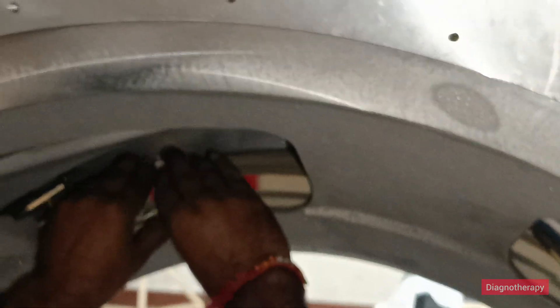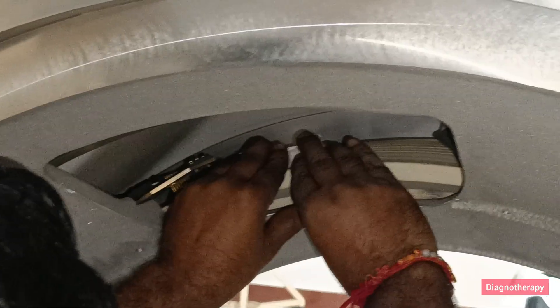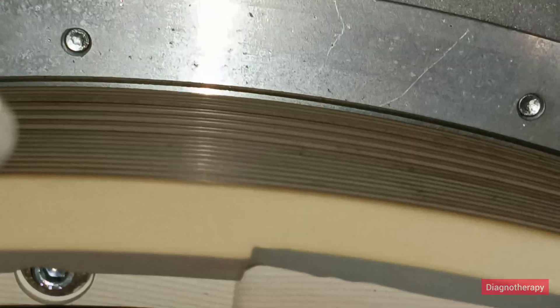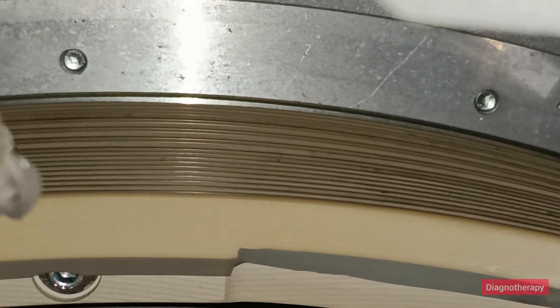The slip ring cleaning process is in progress. Manually we are moving the whole system and cleaning it. You can see many concentric circles — these are responsible for transmitting power and image data. From the front side you can see how we are manually rotating the system for cleaning.